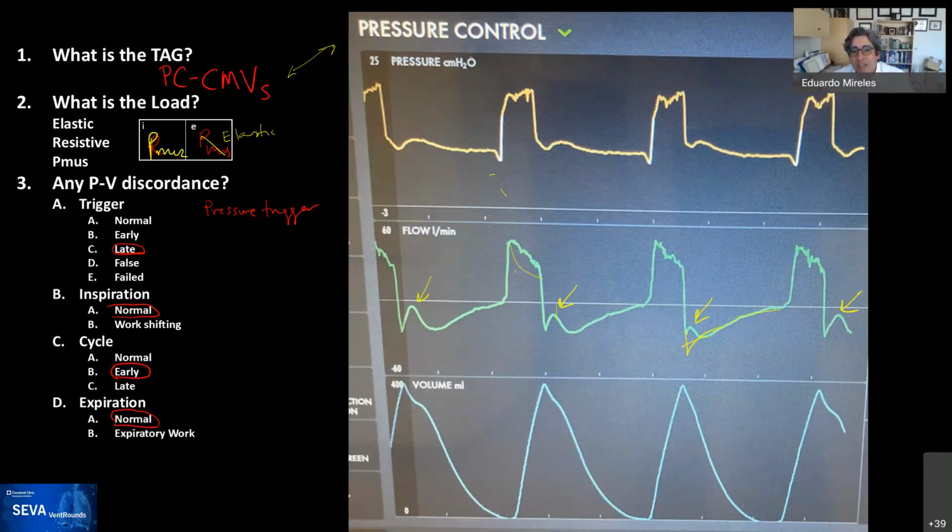So in reality, the best study that I could find when we were trying to define this said that the majority of the ventilators can trigger with a delay no longer than 100 milliseconds. And that's what they have outlined. Majority of current ventilators respond within 60 milliseconds.